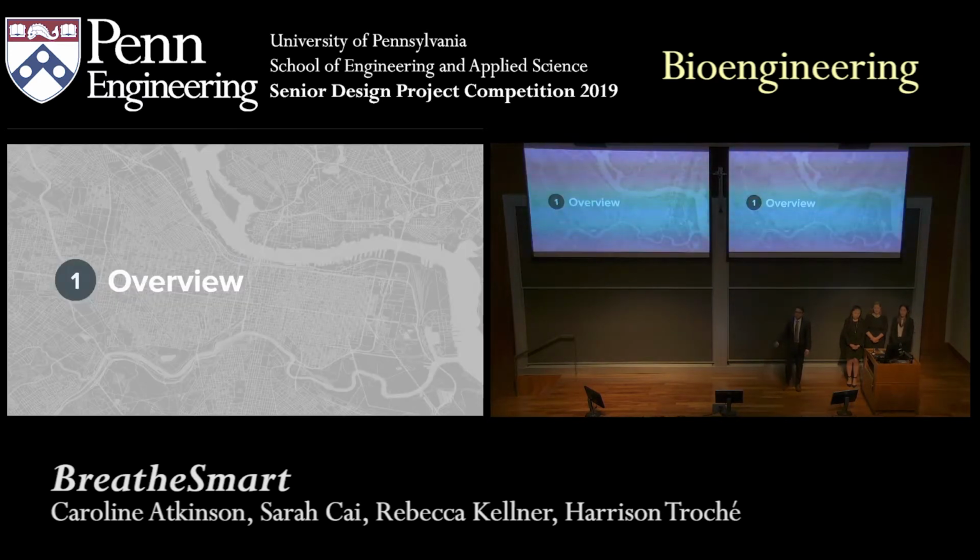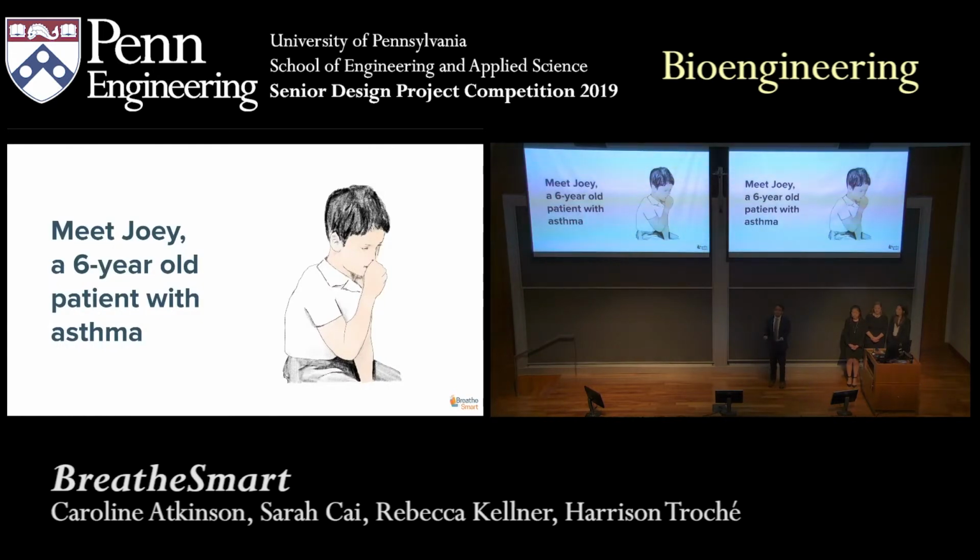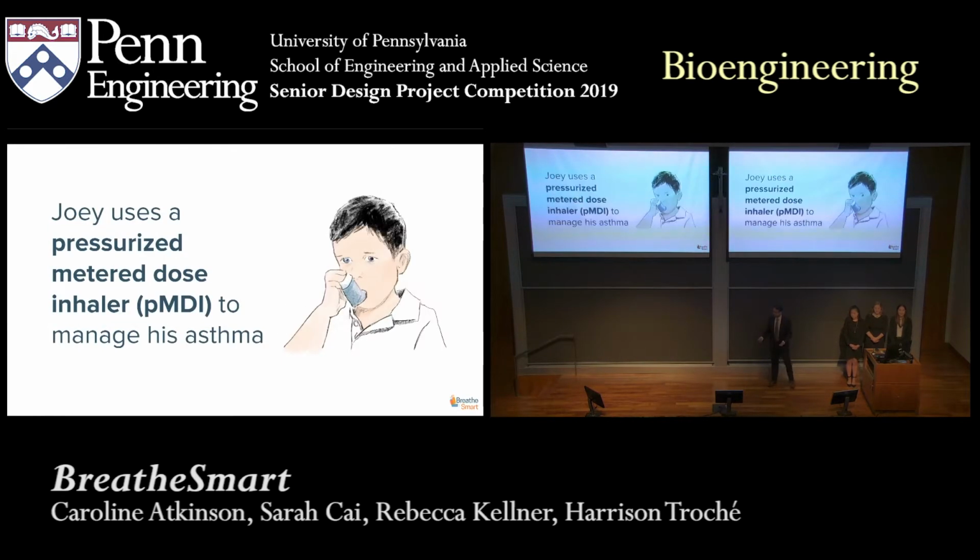So first, overview. Everyone meet Joey. Joey's a 6-year-old patient with asthma. Joey's prescribed a pressurized metered dose inhaler, or a PMDI, for both maintenance of his asthma and in the case of an emergency asthma attack.